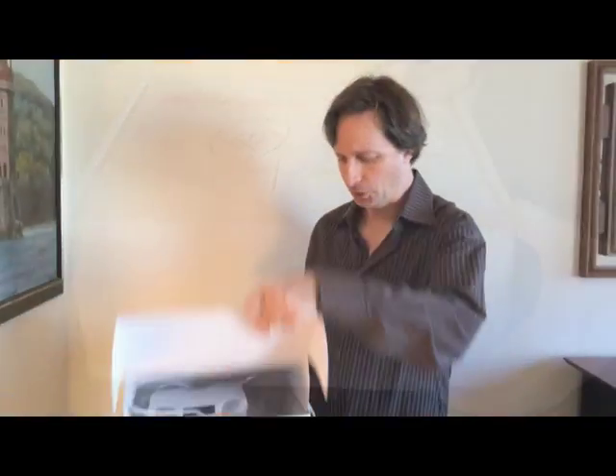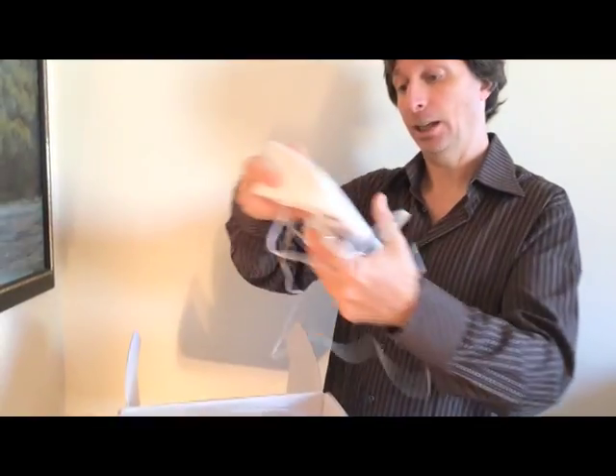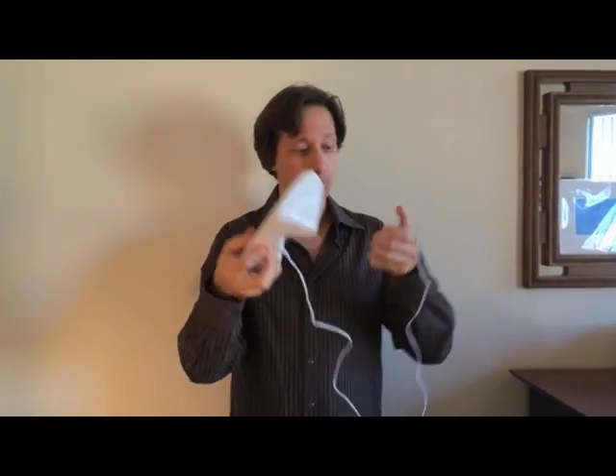Right out of the box, we see not a lot of stuff in here, which is good. We have the base unit right here. We're just going to take it out of the box and plug it in. As you see, there's no phone jack or anything — it just comes with a plug. There's an on-off switch, plug it in, and you're ready to go.